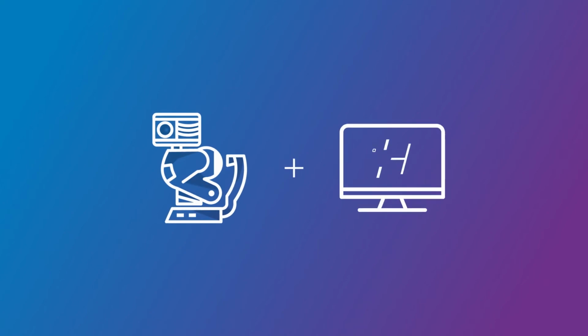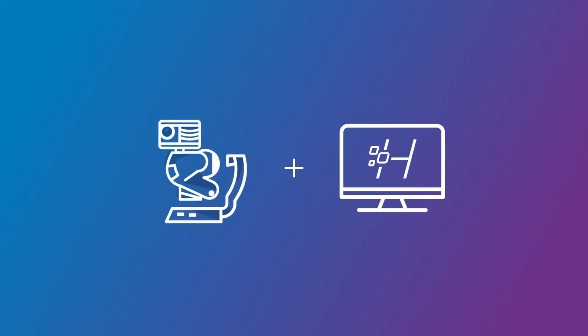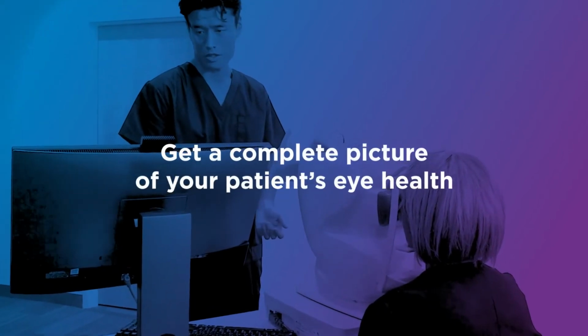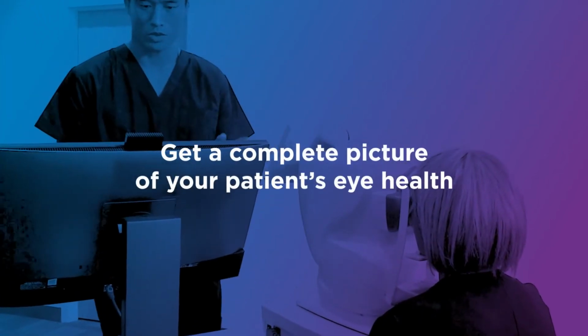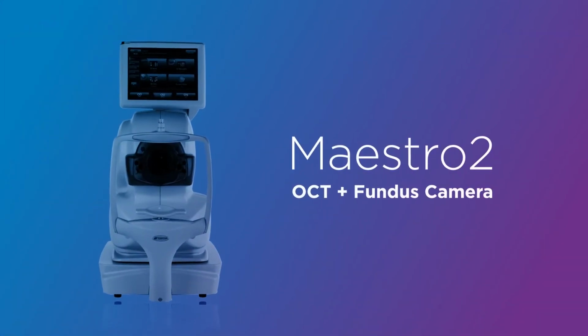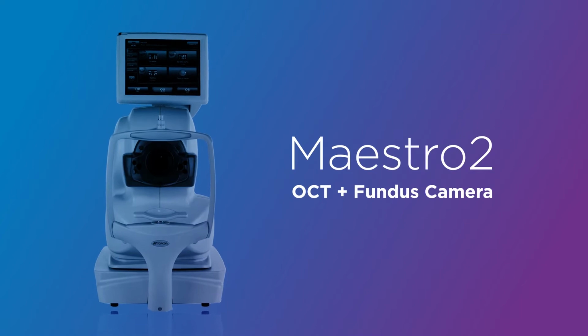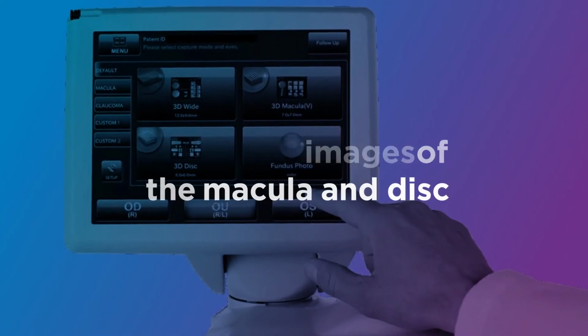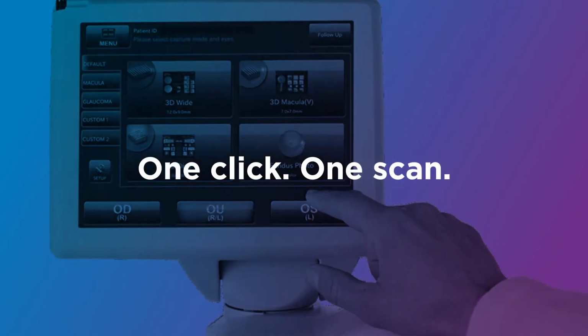Topcon's Maestro2 with Harmony Clinical Data Management is a one-touch, one-screen diagnostic solution that gives you a complete picture of each patient's eye health, simply and easily. Maestro2 is an automated OCT plus fundus camera that empowers operators to capture images of the macula and disc with a single click and in a single scan.